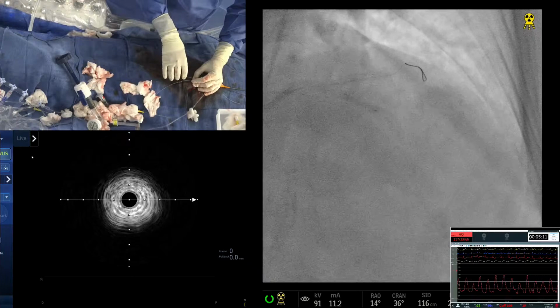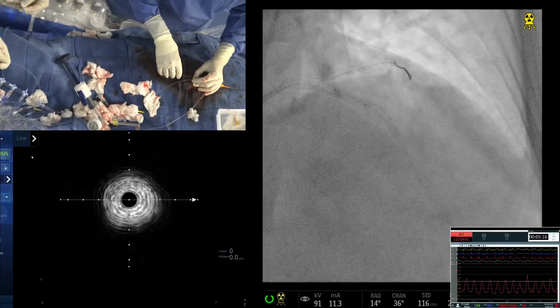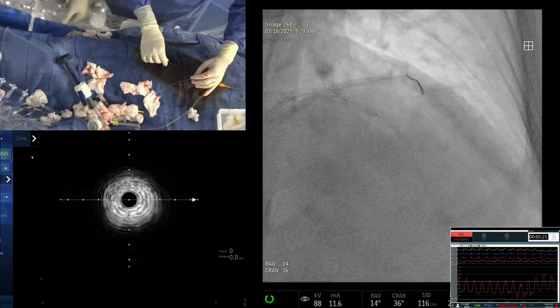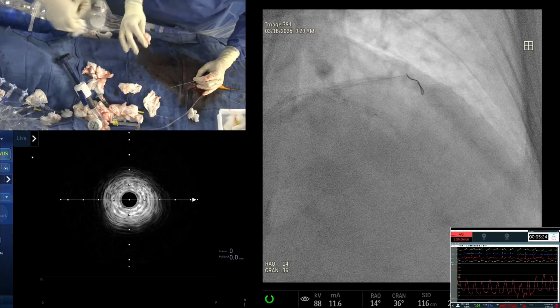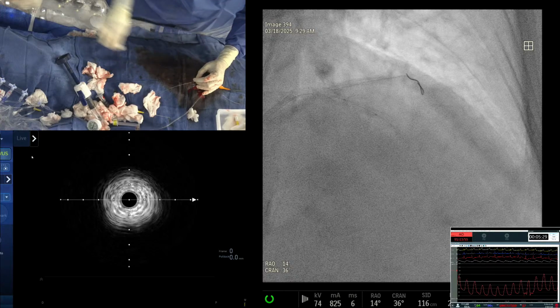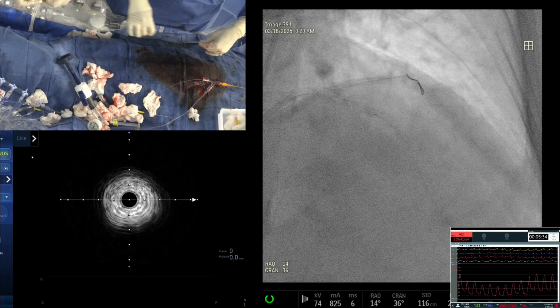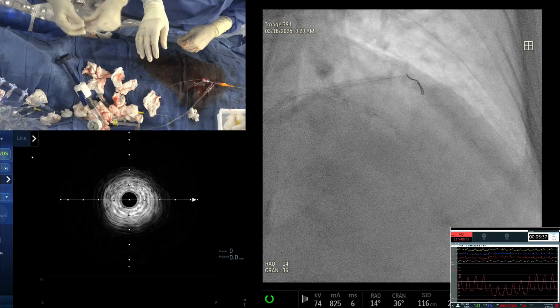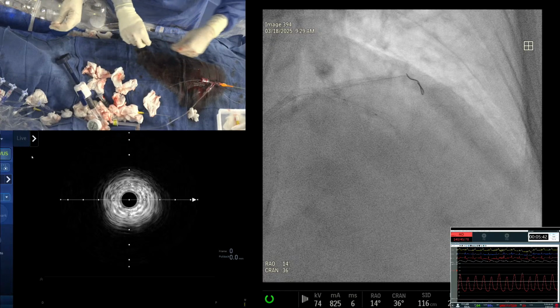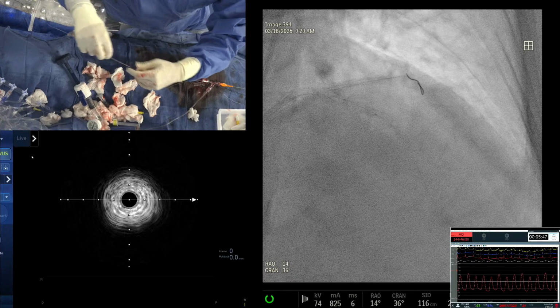We just don't carry it yet because of the cost. A 2.0 or 1.2 balloon, no? No, 2 may not go. We have the 1.5, no? Yeah, 1.5 you gave it. From a teaching point of view, that's an appropriate second step once your IVL did not go. Lacking the Opan balloon in our lab, we will use a cutting balloon. But yes, I did cutting in the side branch. I see. Yeah, okay. The Opan balloon is appropriate.